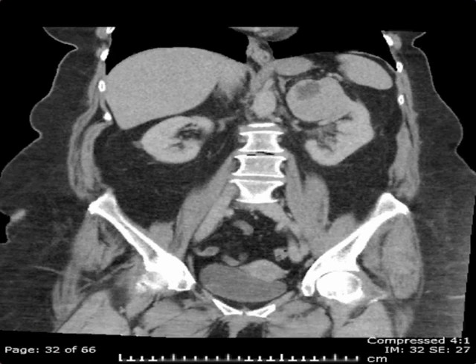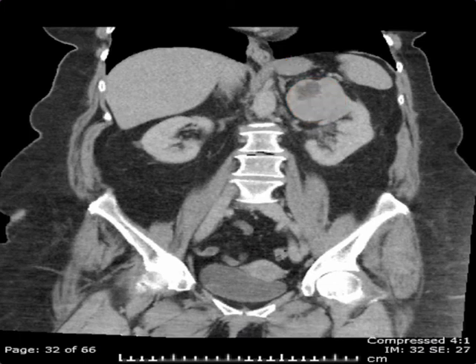Once again, you can see an exophytic, predominantly solid mass arising from the upper pole of the left kidney, compatible with a renal cell neoplasm.